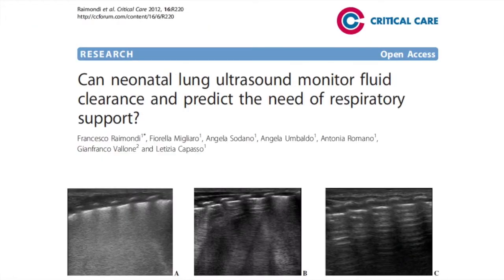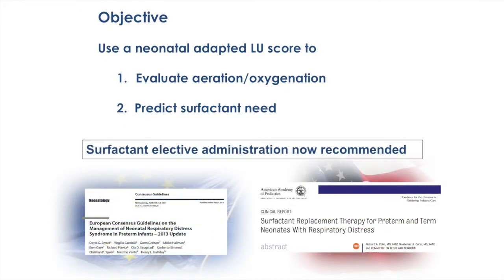Now, could neonatal lung ultrasound monitor fluid clearance and predict the needs of respiratory support? In the current European guideline, it is recommended to provide surfactant early but electively. The objective of the following study was to evaluate if lung ultrasound was correlated with oxygenation scores and could predict need for surfactant.